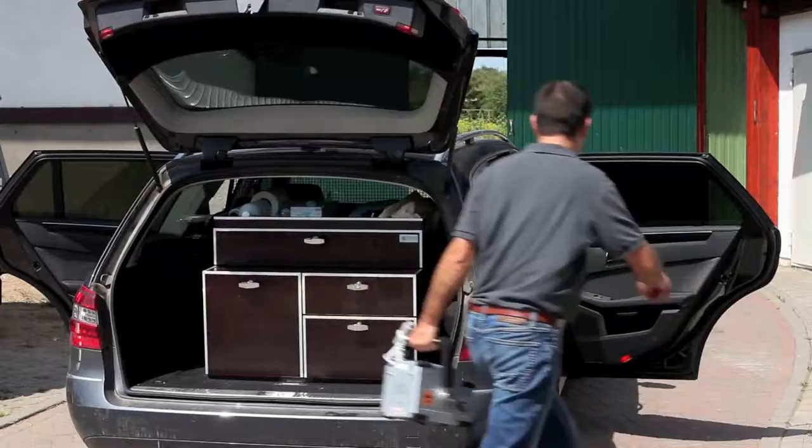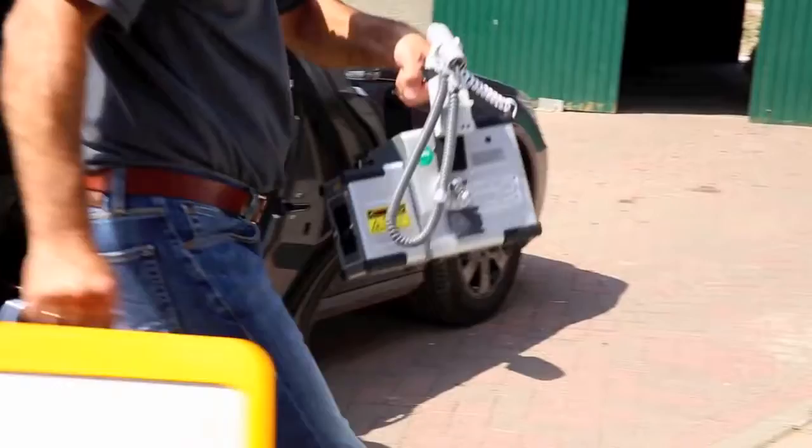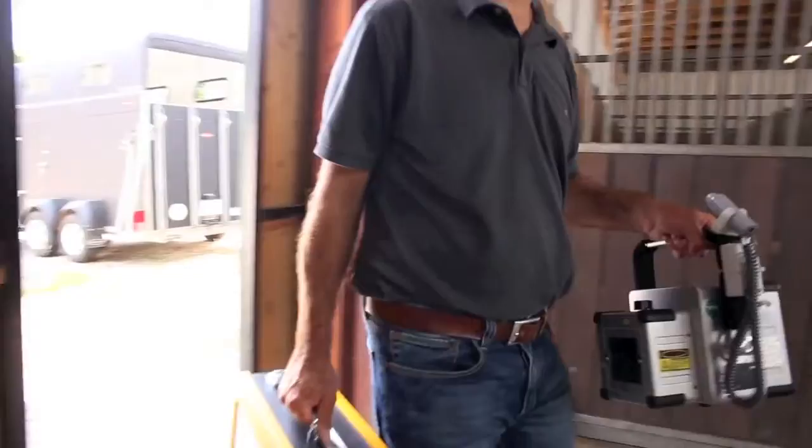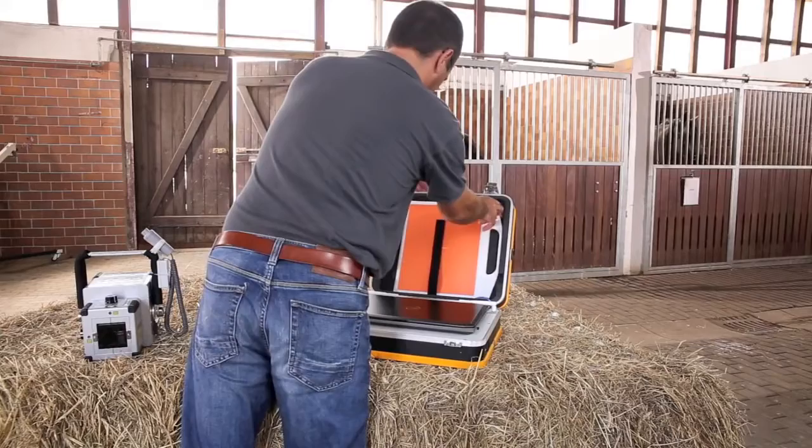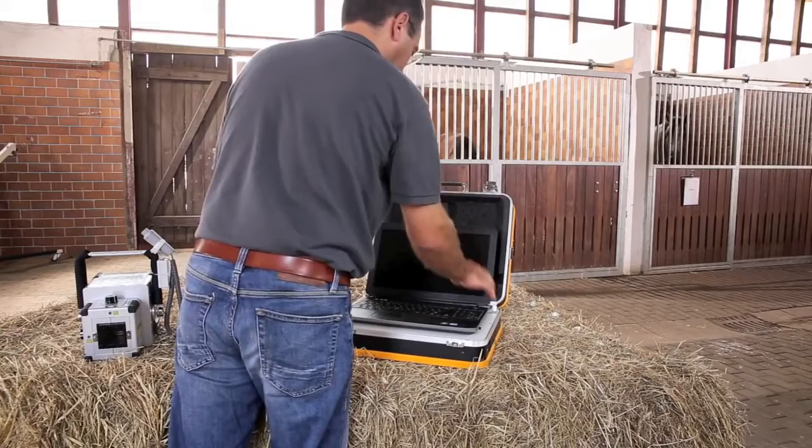The small and compact suitcase fits behind any car seat and can therefore be transported anywhere without taking up much space. Setting up the entire Leonardo Mini System is uncomplicated and takes less than 30 seconds.